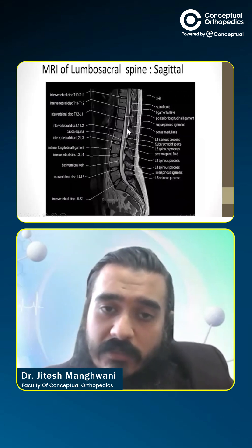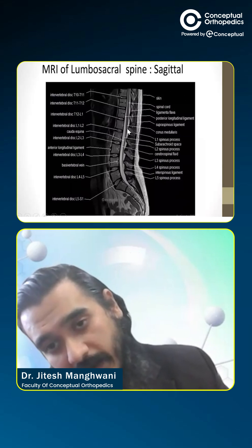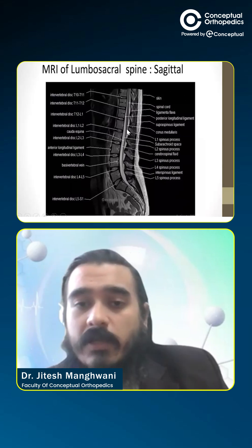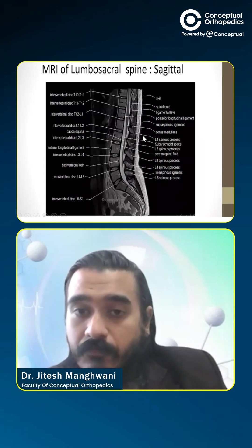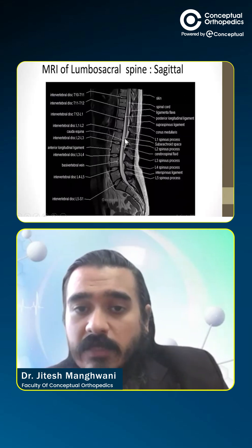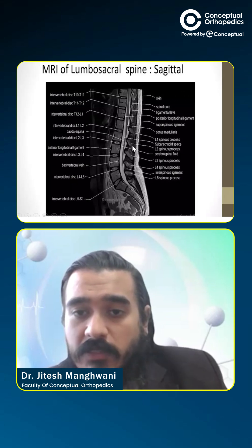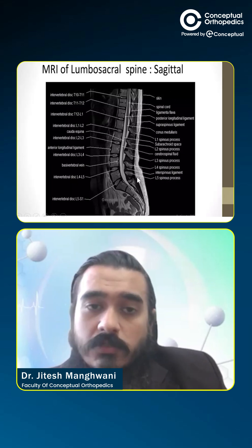Conus medullaris is the area where the spinal cord ends, commonly at T12 or L1. L1 spinous process, subarachnoid space, L2 spinous process, the CSF fluid, L3 spinous process, and so on and so forth.